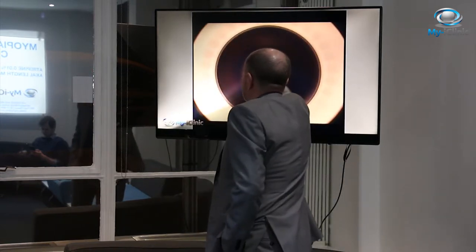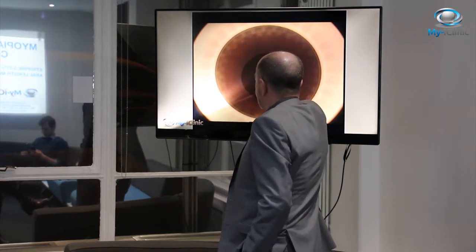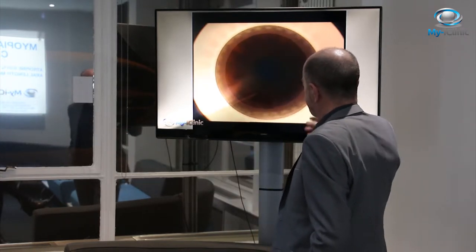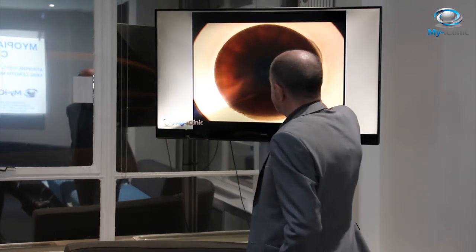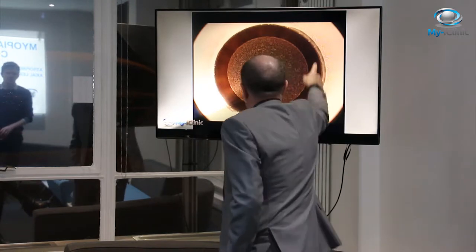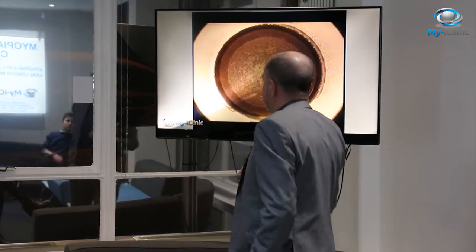This ring is a reflection of the cornea — the ring of light the patient is looking at. They're staring at the yellow dot, so we know that is the visual axis. We get this ring concentric with it, and then you'll see the ring of contact with the cornea. The refractive cut starts — it's cutting that deepest refractive cut, spiraling in. Then we cut the outer ring, then the cap cut on the anterior surface. There's a bit of overlap, and then the cut through which the lenticule will be removed.